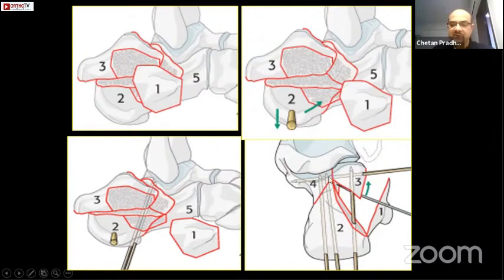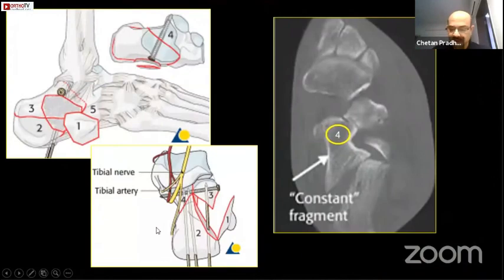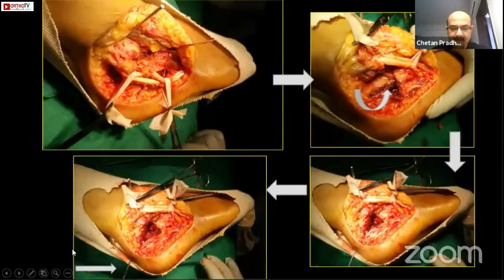The next important step is correcting the heel varus. Fragment number two has to be reduced to fragments three and four by temporary K-wires, correcting the varus and taking a good axial view. In live surgery, this is what it looks like — this is a depressed fragment, so you elevate it up, and I usually transfix it with the talus with a K-wire going from the posterior side into the talus.